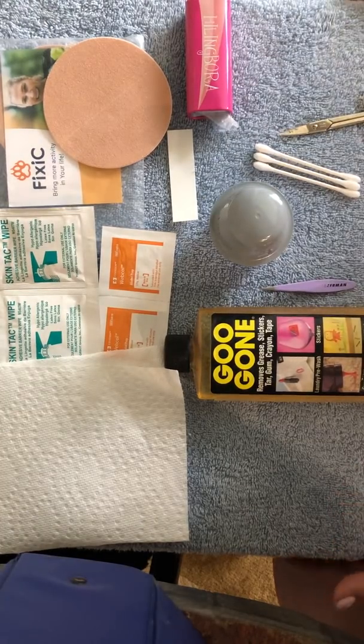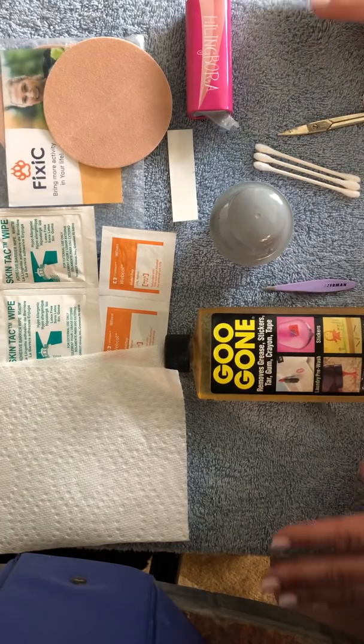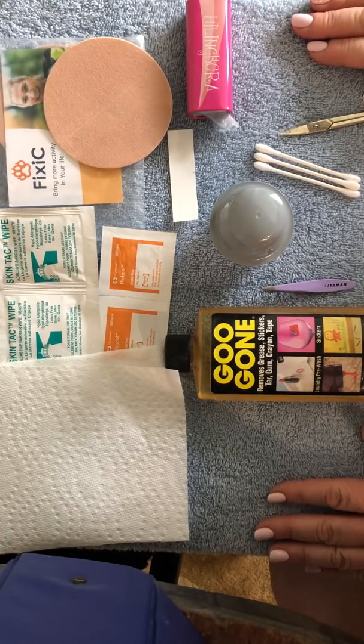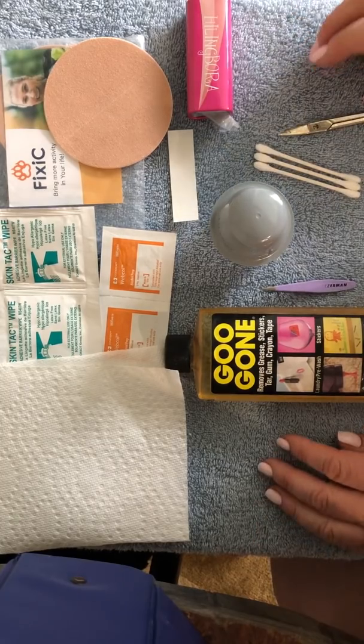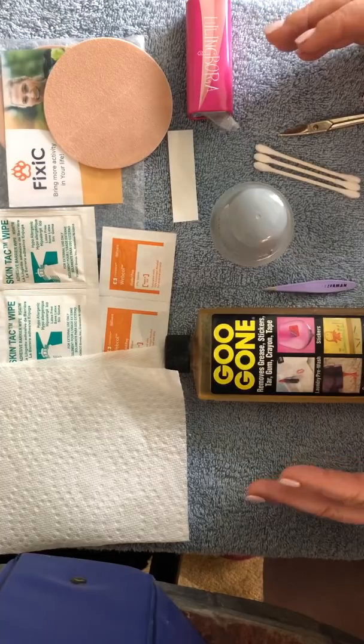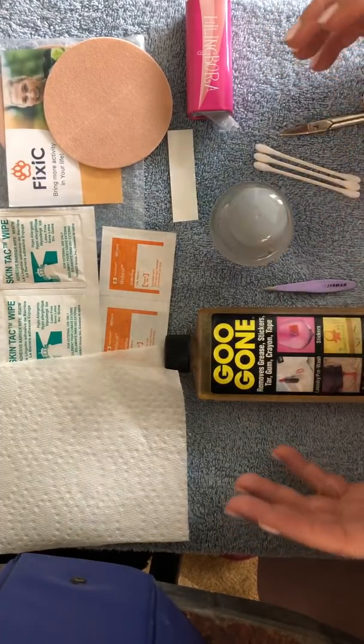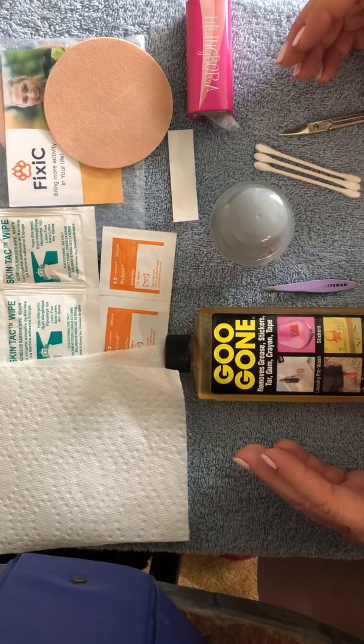Hi everyone, I am here to show you how to replace the adhesive that comes standard with the Libre 14-day sensor. I did use the 10-day, and I never had a problem, but as soon as I turned over to the 14-day, I started having a bad reaction within a day to the adhesive that's on there.